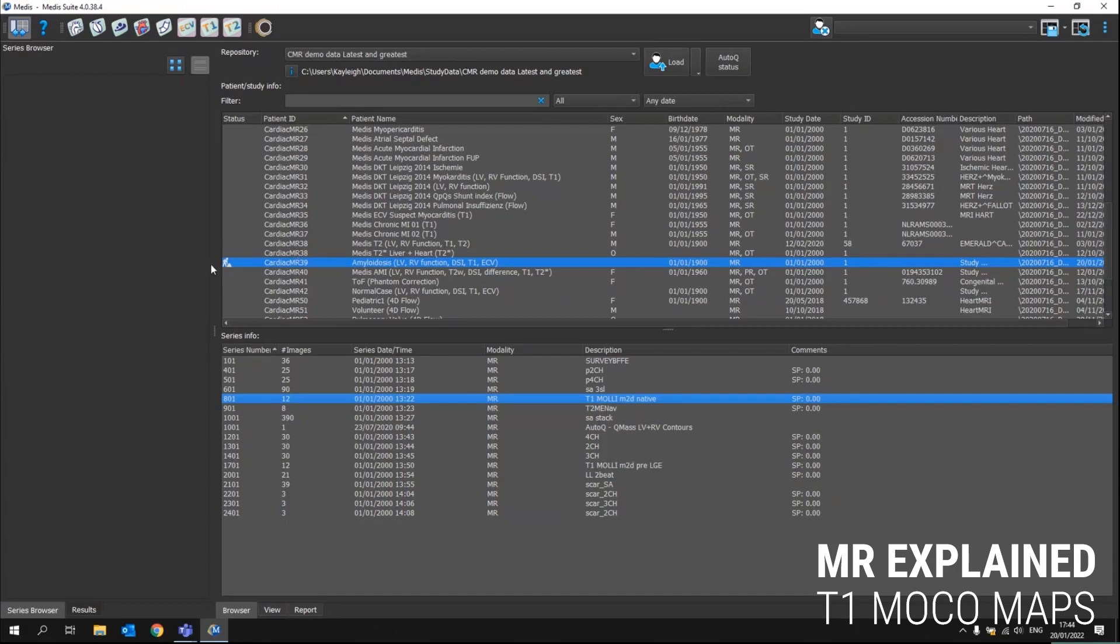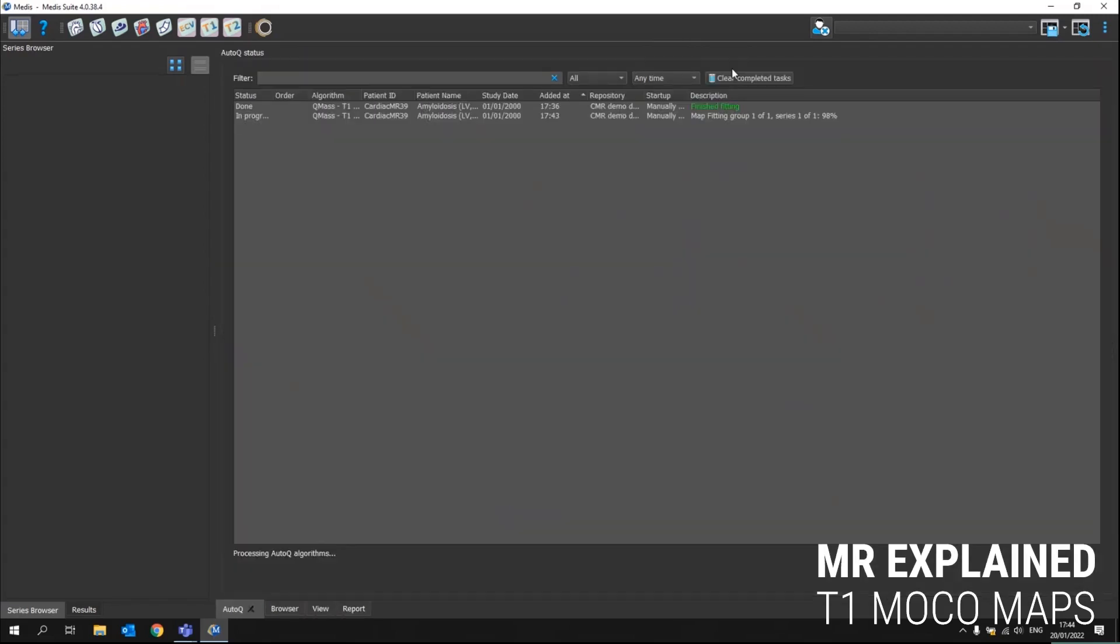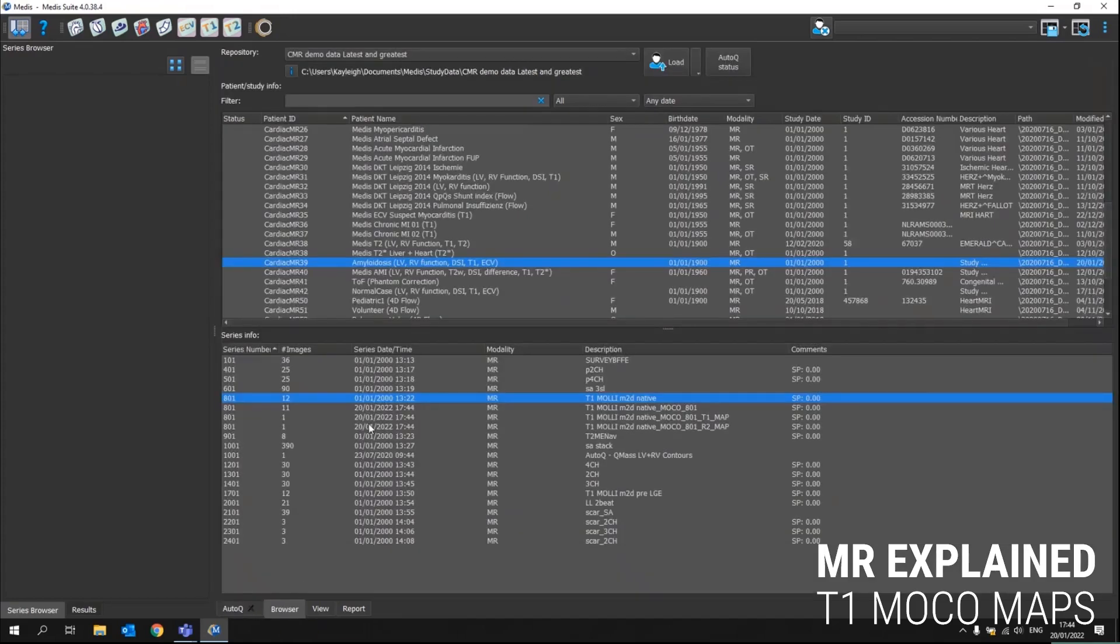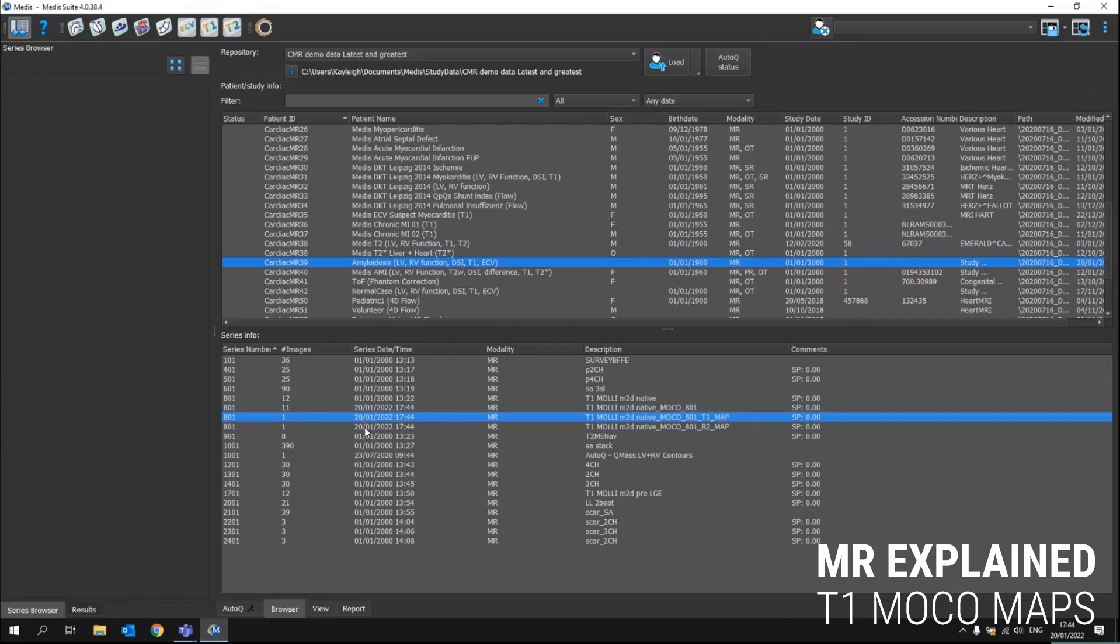Here up front, we can already see that the algorithm is running and then in the AutoQ status here at the top, we can see how far along it is. We can see actually it's almost there. Here we go. We'll go back to the browser and here we see that indeed first the motion corrected series has been created and based upon that the T1 map and the R square map.